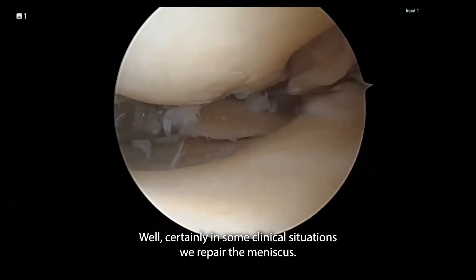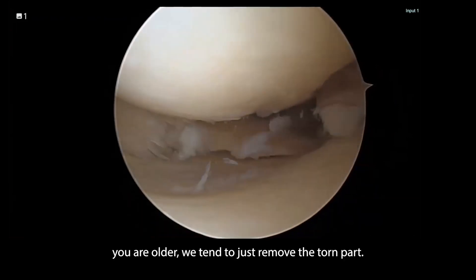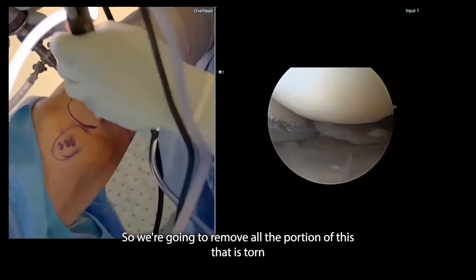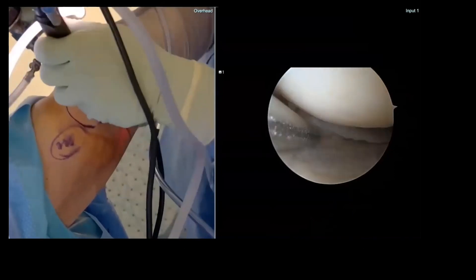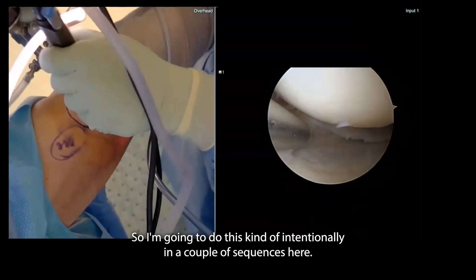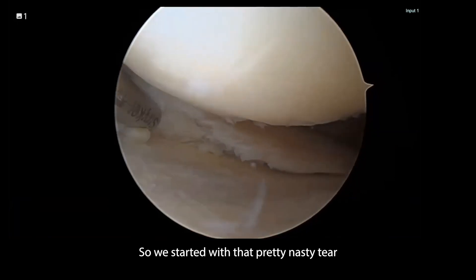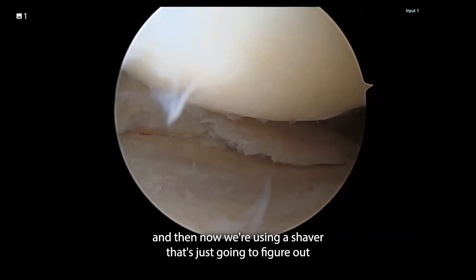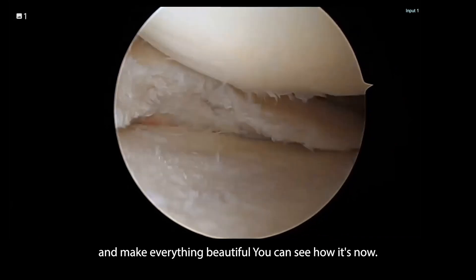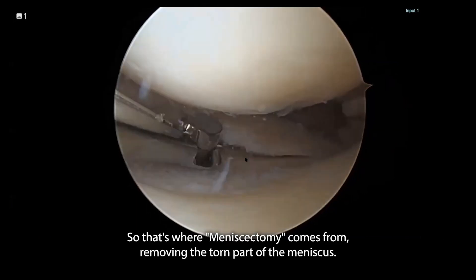All I'm doing is biting away the torn part of the meniscus. You hear people talk about having their meniscus repaired — certainly in some clinical situations we repair the meniscus, but when you've developed arthritis changes or are older, we tend to just remove the torn part. We're going to remove all the torn portion, and what we leave behind will obviously be far less tissue, but nothing will be caught or hanging in the joint. Now we're using a shaver to take out all the damaged tissue and make everything beautiful again. That's where meniscectomy comes from — removing the torn part.